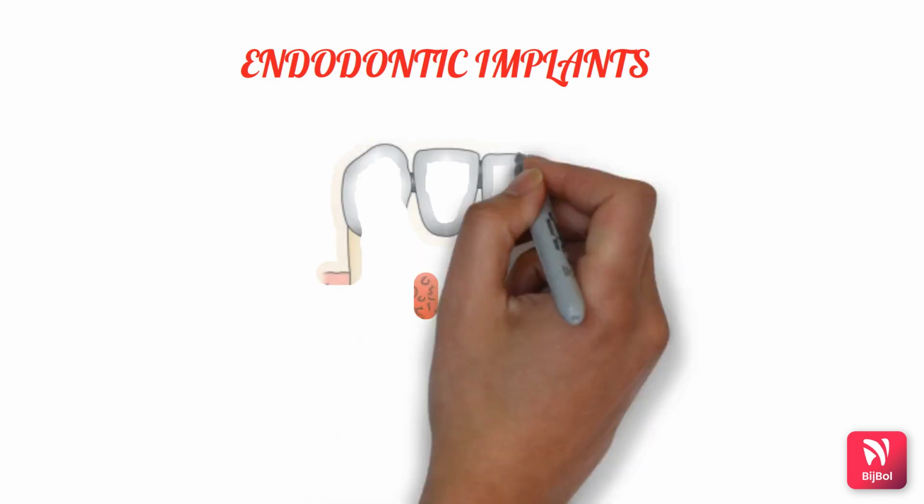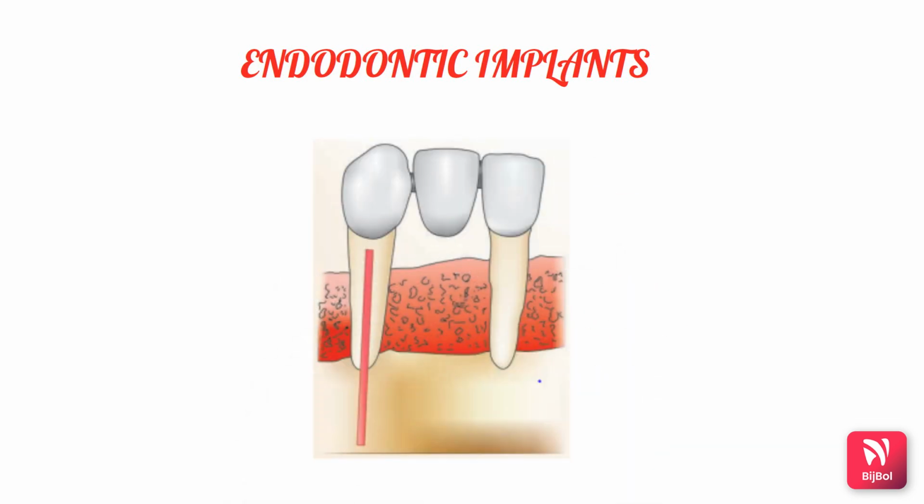If you see the endodontic implants, these are used for providing stabilization of the teeth in which the alveolar support is lost due to endodontic and periodontal disease, which also helps in enhancing the root anchorage by extension of the artificial material beyond the alveolar socket but within the range of the alveolar bone. So that's how these endodontic implants are placed.